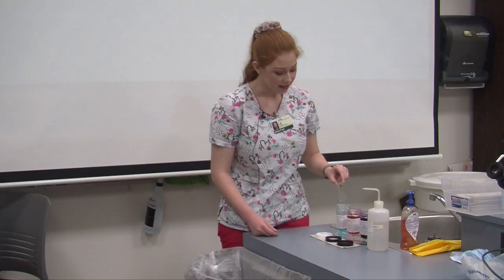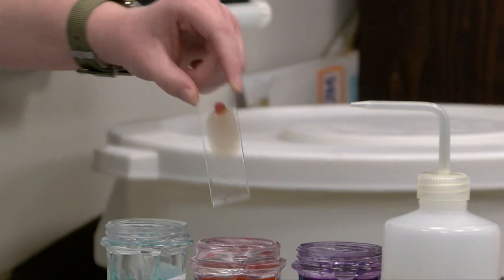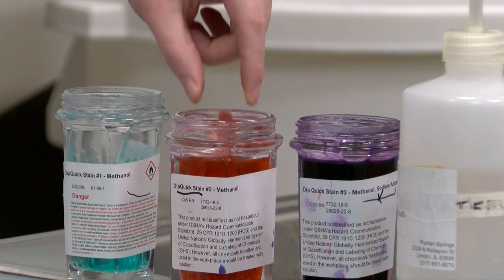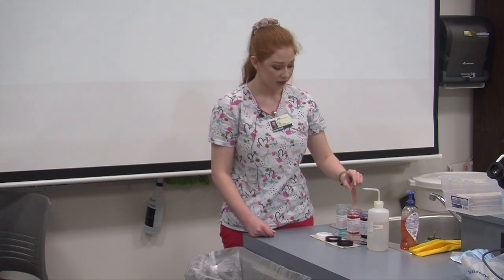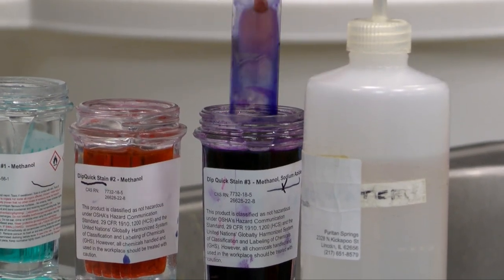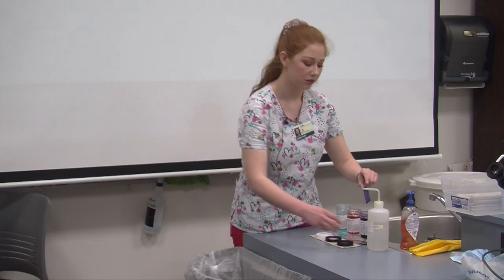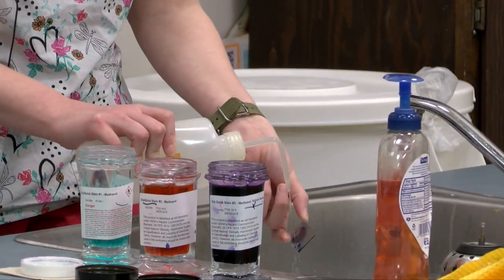Let it drip off a little bit. Now I'm going to dip my blood smear in solution one, which is our red solution, five times: one, two, three, four, five. Let that drip off as well. Then lastly I'll put my smear in solution two, which is blue, five more times: one, two, three, four, and five. After that I want to use distilled water and rinse my slide off, then allow it to dry.